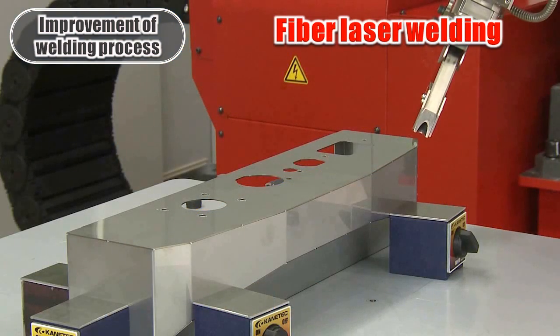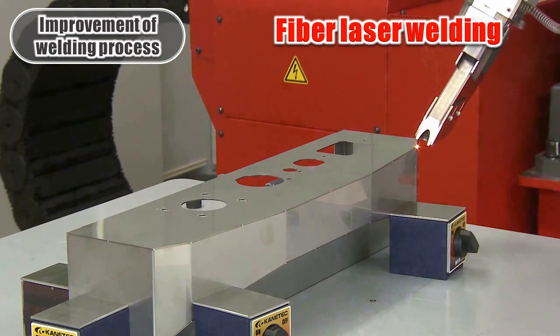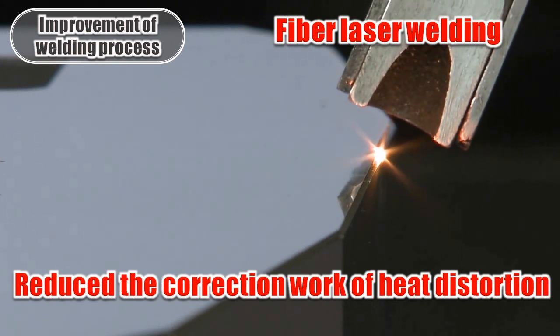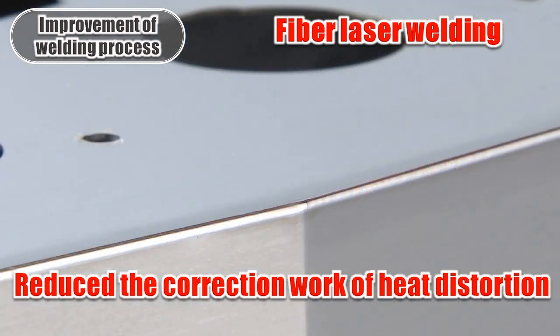By replacing this with the latest fiber laser welding that can limit the heat effect during welding to a minimum, we can reduce the time for deciding the welding order, tack welding, and correcting the distortion. Very effective for shortening the lead time.